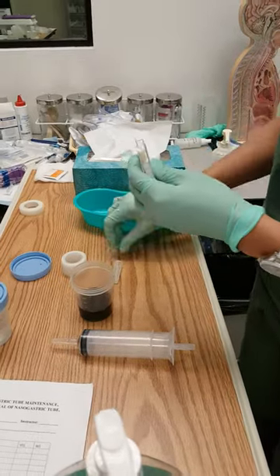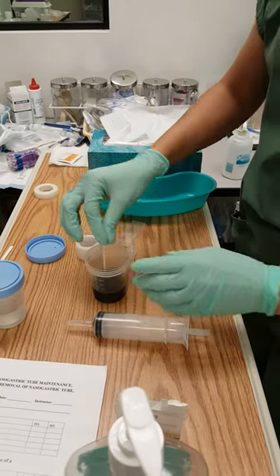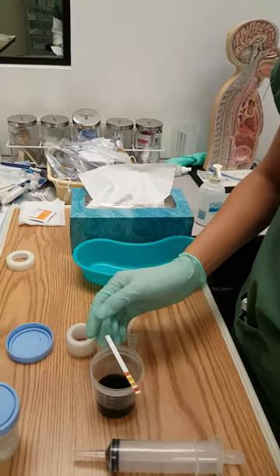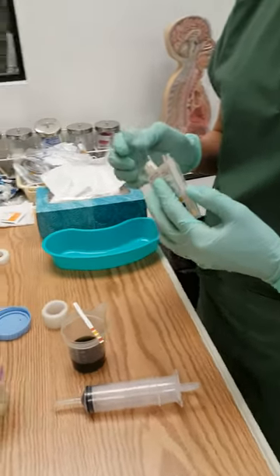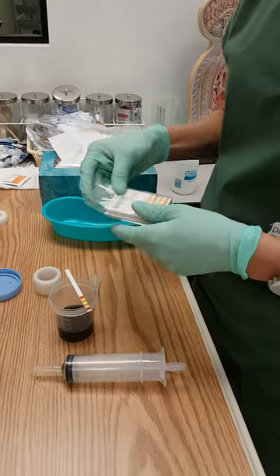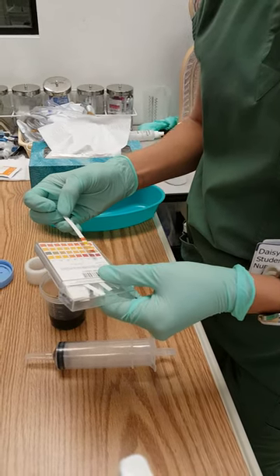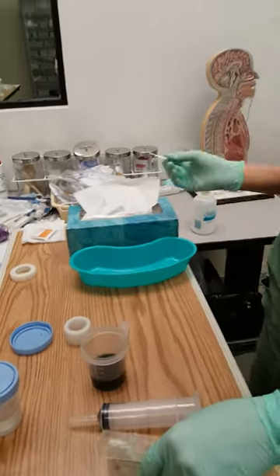I'm just gonna check the gastric pH, and it should be under 5. It looks like it's between 2 and 3. So I'm just gonna discard this.